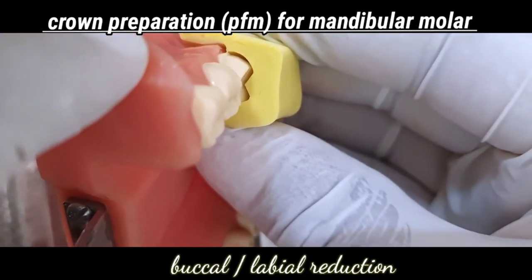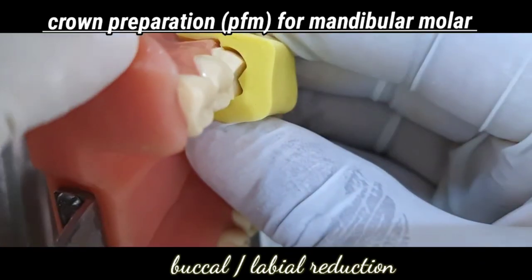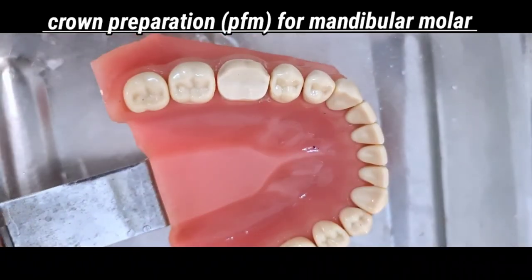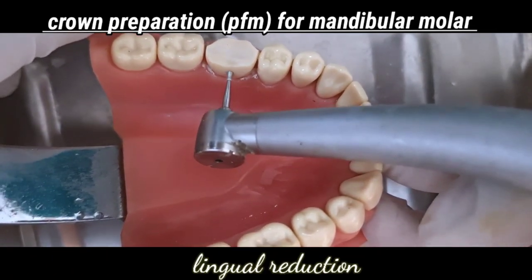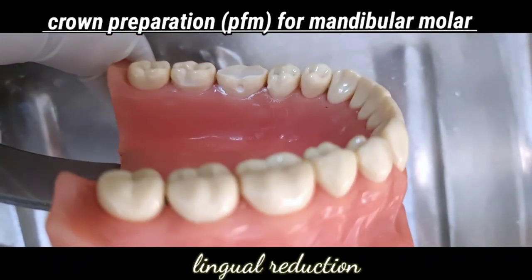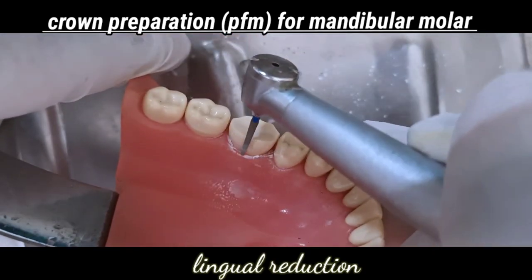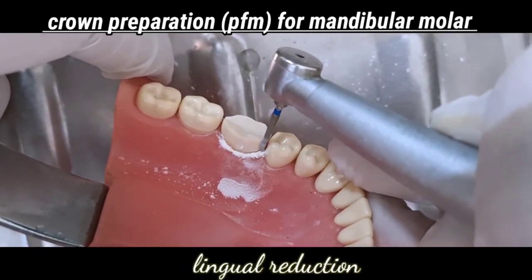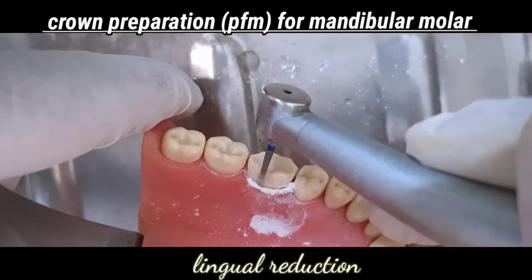And once we have achieved the labial reduction, then we proceed with the lingual reduction. On the lingual surface, one depth groove or depth cut is enough. Using a push or pull stroke, a definite margin is created. The margin should be preferably supragingival to conserve the tooth structure. So axial lingual reduction is done from 1 to 1.5 millimeter.